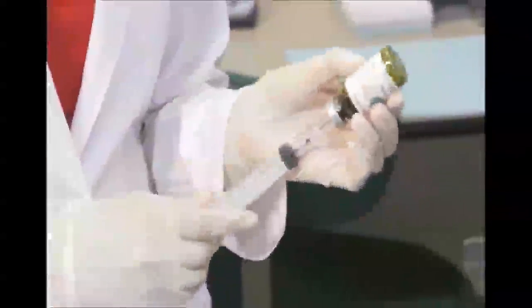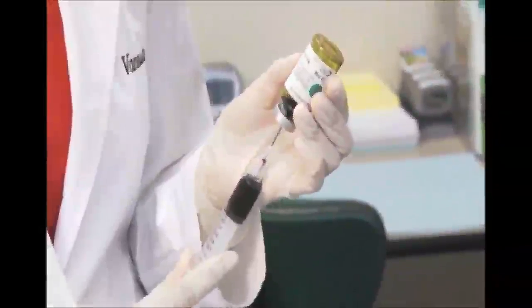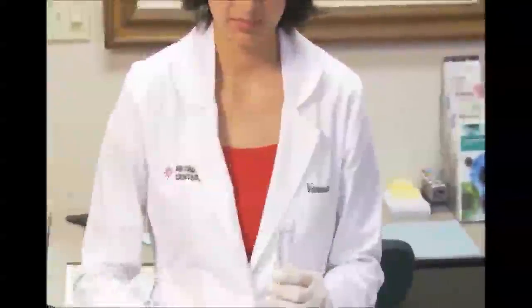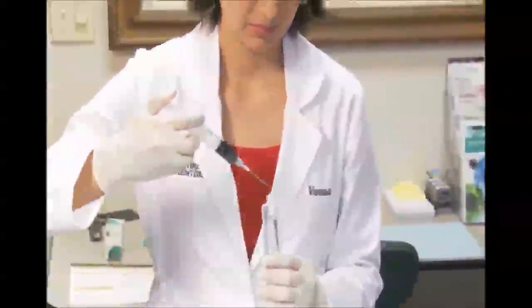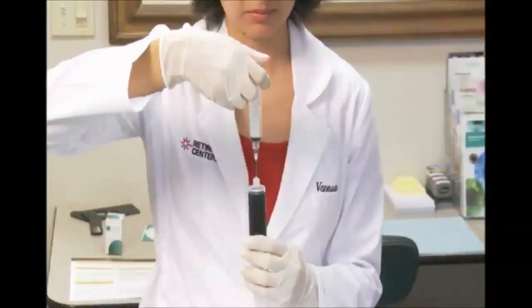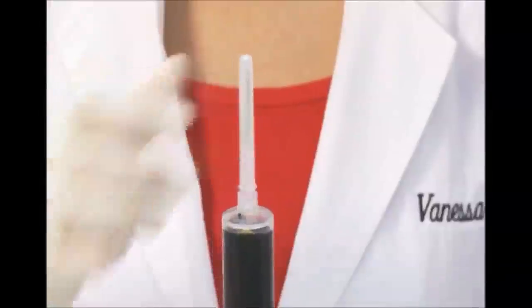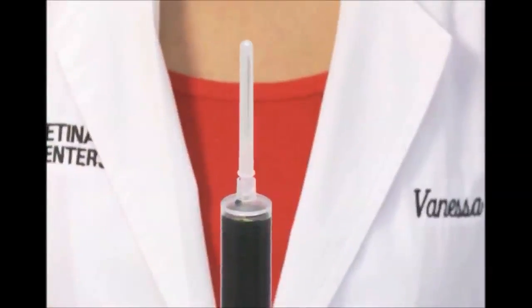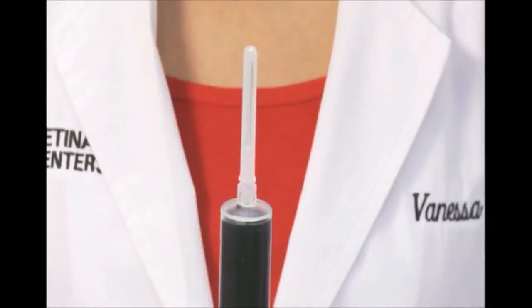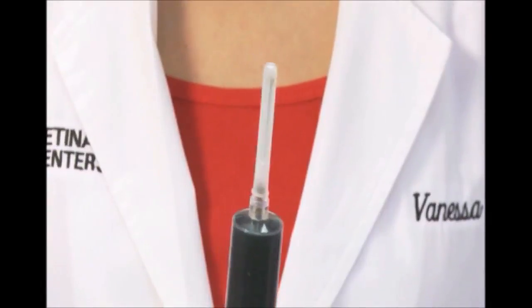Now, withdraw the appropriate amount of Visudyne for your patient's infusion and set it aside. Carefully remove the needle from the 30 mL syringe and add the Visudyne solution to the D5W. The total volume will now be 30 mL of properly diluted Visudyne and D5W inside the 30 mL syringe. Do not use normal saline or other parenteral solutions other than D5W and do not mix in other drugs.